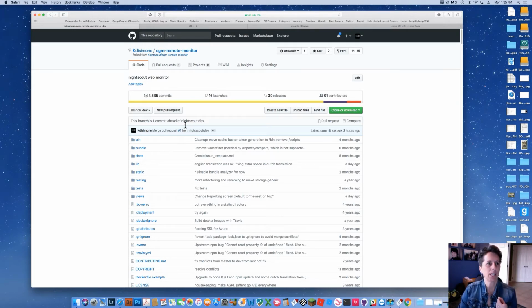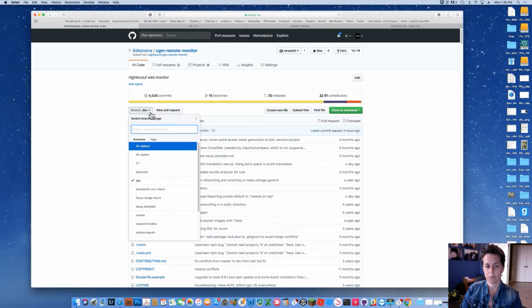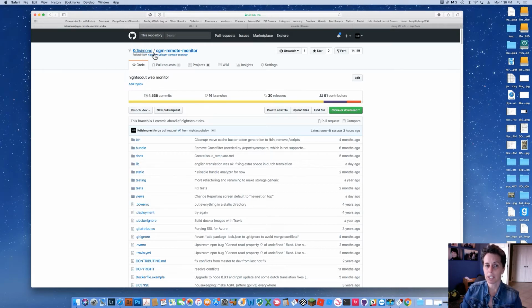But maybe there's something that I want to tweak for myself. And so what I might want to do is tweak a color in the background of my nightscout site. Maybe I want one of the pills to be a different color or something just changed and personalized for me. So what I want to do is make my own version of that cookbook in my own home library. And let's say I like the dev branch. I'm going to switch to the dev branch. I'm on it. I'm also going to make sure I'm in my own copy.